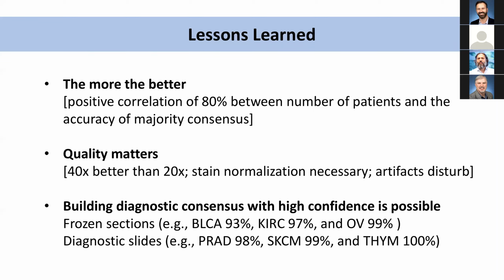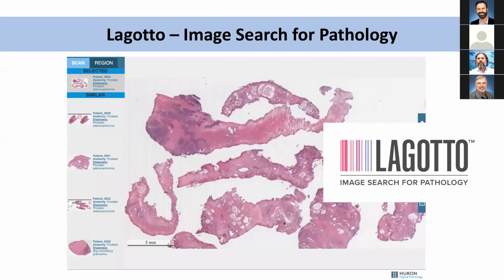But when you're searching in a database of 30,000 patients and samples and 20 million patches, the likelihood that you hit it randomly is quite low. So there is something there in search that we have to exploit.